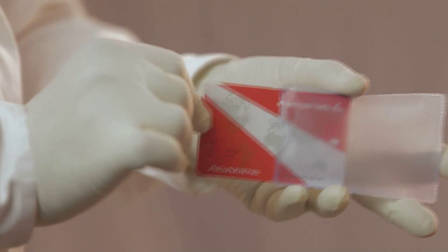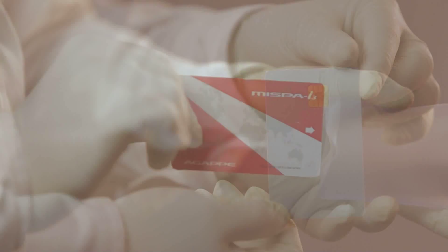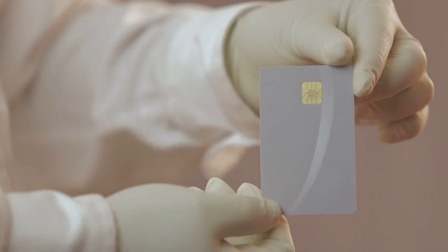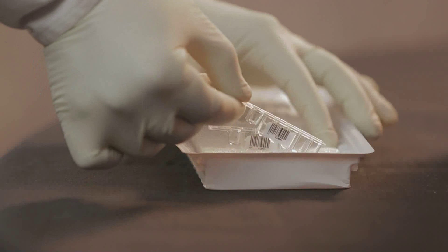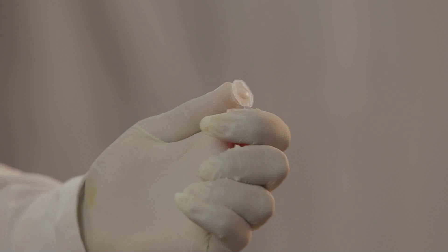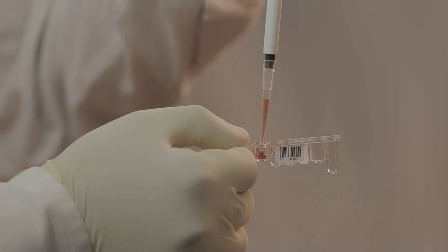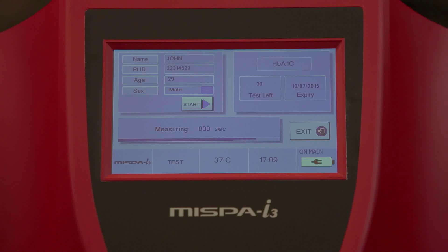Pre-programmed assay protocols developed and manufactured by Agape Diagnostics provide highly sensitive and reproducible results. The cartridge of reagent consists of pre-filled latex reagent and buffer solution. Depending upon the assay type, you can run between 10 and 20 tests per kit, with assay time between 5 to 10 minutes, making it suitable for laboratories of all levels of throughput.